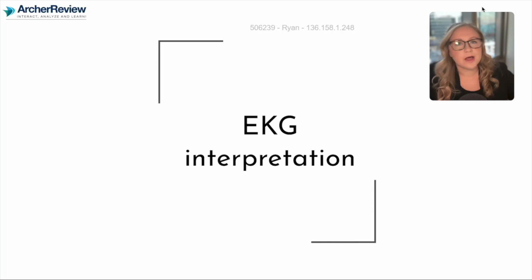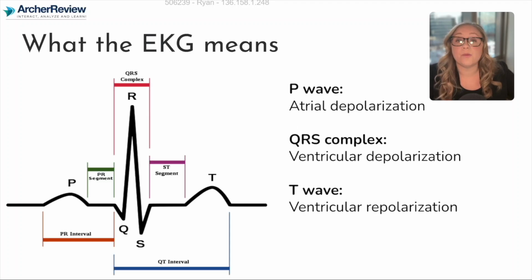Now, I know a lot of you didn't get a thorough review of EKGs in school. That's okay. We're going to break it down, make it nice and simple so that you know the basics you need for the NCLEX. And that means we need to start off with simply what an EKG actually means. I promise this is going to make everything so much easier when you go to interpret your findings.